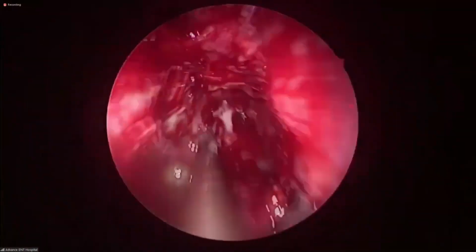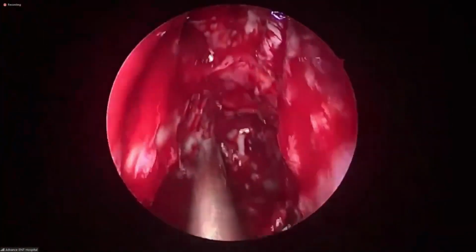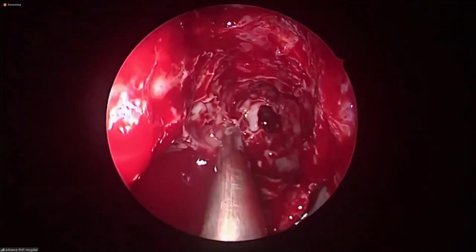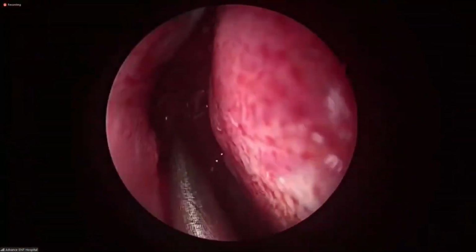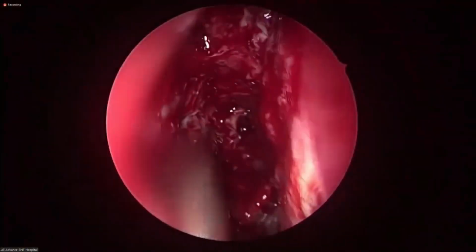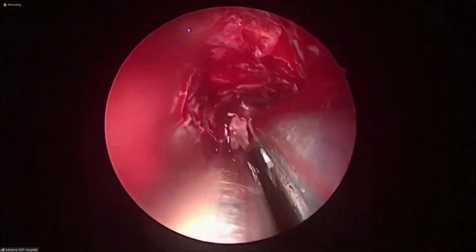See now the final work, Carison. Now final work is going to be widening this. See this anterior wall? Yes, sir.